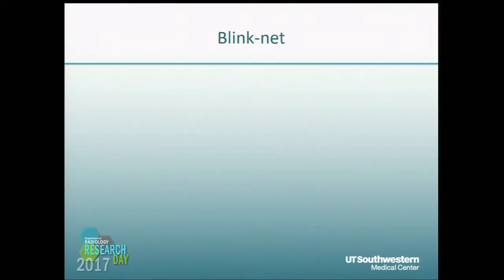Our network is BlinkNet. Because we had limited data and it was domain-specific data, we could not just use the models from ImageNet. Thus, we had to create our own, and we experimented with hundreds of designs. We did borrow some design elements from the ImageNet models.